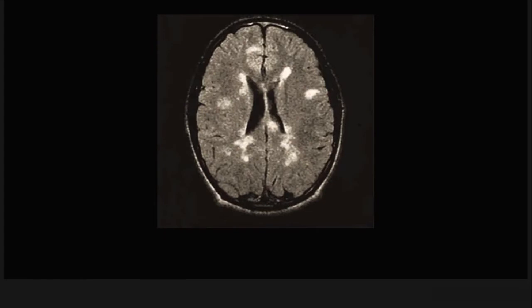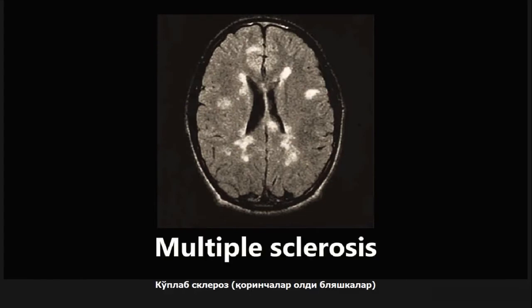This next one is a brain MRI — and this is an example of multiple sclerosis. What you're seeing here are these periventricular plaques — these areas of white around the ventricles. If you see this scan, it's almost a dead giveaway for multiple sclerosis. There's really nothing else that looks like this.